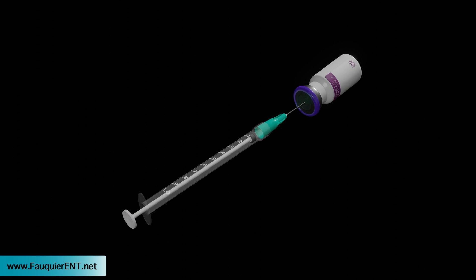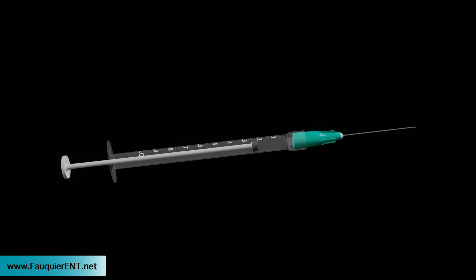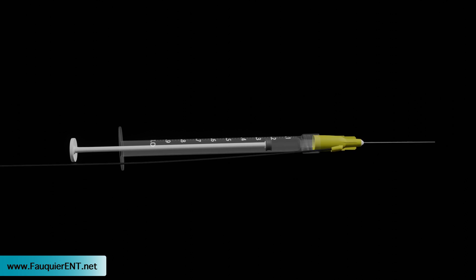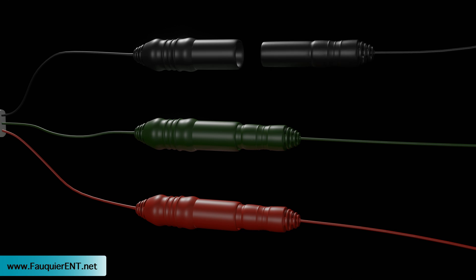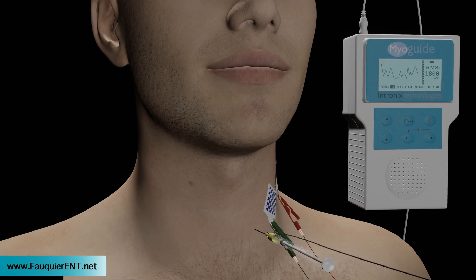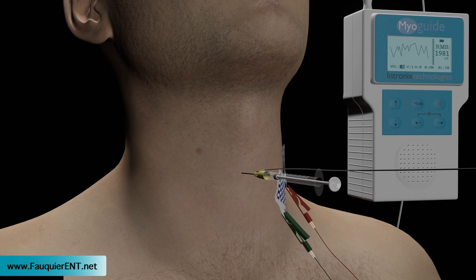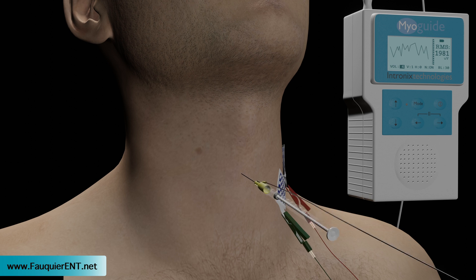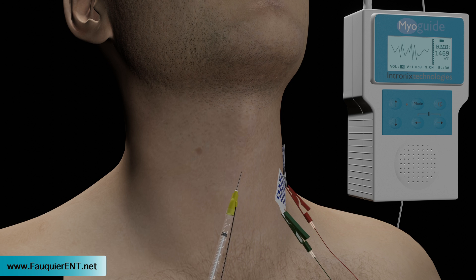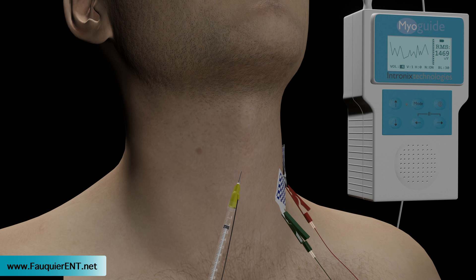The appropriate amount of botulinum toxin is prepared within a 1cc syringe and a needle electrode attached. This in turn is connected to the EMG's black connector. The syringe containing the botulinum toxin and needle electrode is then inserted into the cricothyroid space and directed both superiorly and laterally to where the vocal cord muscle is located.